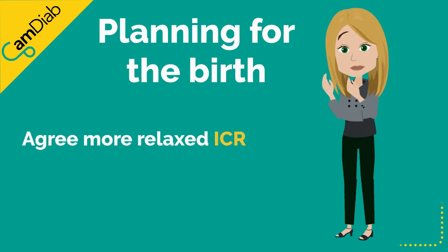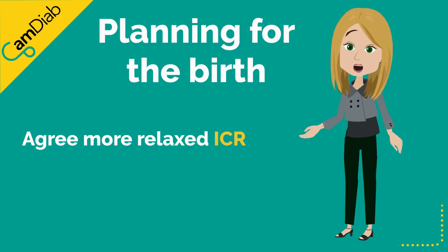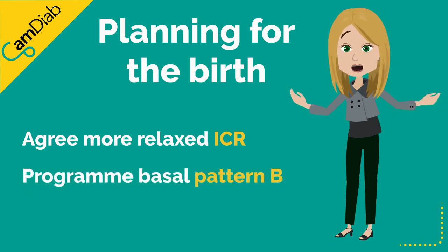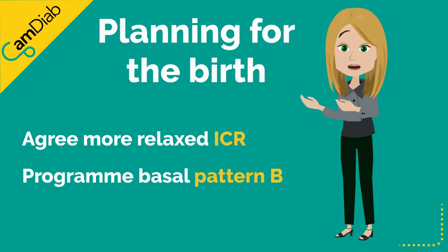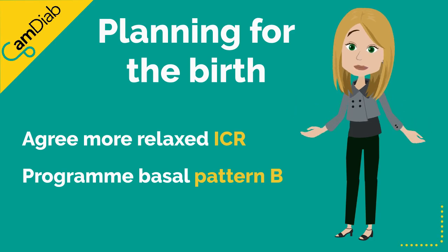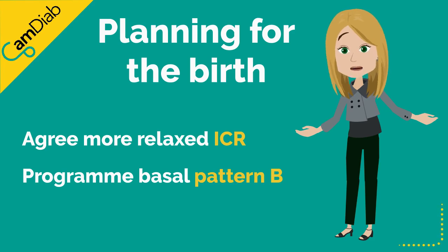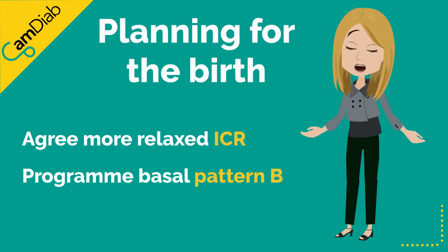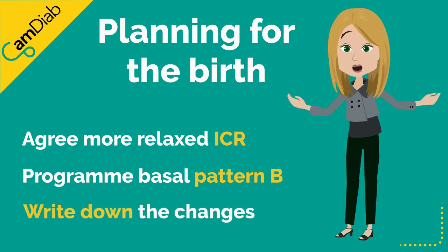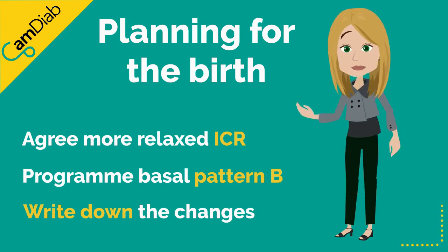Agree more relaxed insulin to carbohydrate ratios with your diabetes team, which can be programmed into the app's bolus calculator settings after the birth. Program a reduced pump basal pattern B on the pump. Pattern A's basal rate would have been increased throughout the pregnancy as a safety net in case CamAPS FX couldn't work. Only swap to pattern B on the pump when the baby is born. All these changes should be written down in your medical notes, and you should also have a copy.